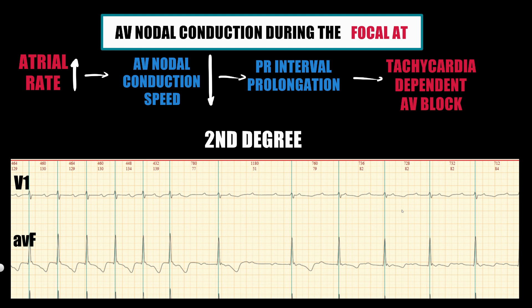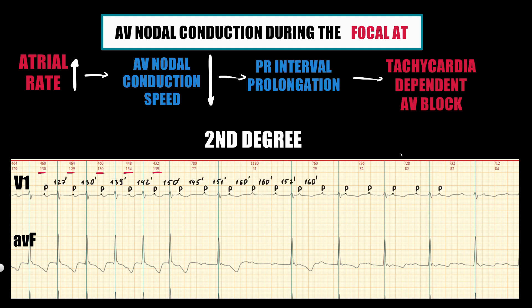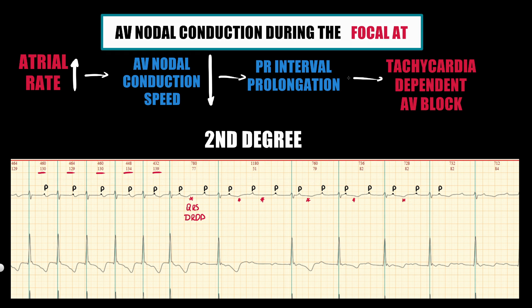In the last ECG example, we see atrial tachycardia with a heart rate of 130–140 bpm. After this, the heart rate slows down to 80 bpm. We clearly see the P-wave and measure the atrial rate increasing from 130 to 160 bpm. Some impulses are not conducted to the ventricles, resulting in QRS dropping. Estimating conduction by counting P-waves and QRS complexes, we see second-degree AV block with conduction ratios of 2:1, then 3:1, then 2:1 again — which explains the decrease in heart rate by half.